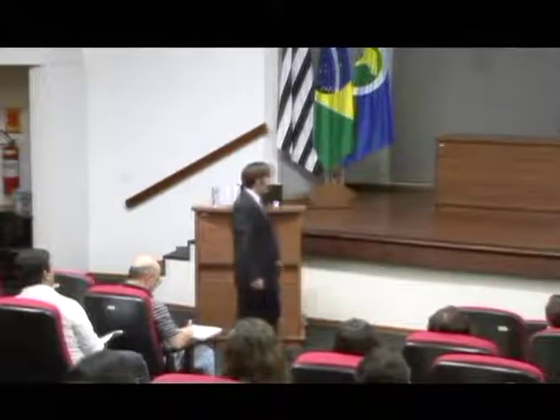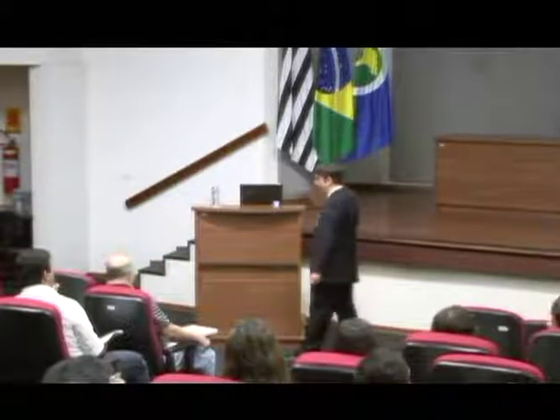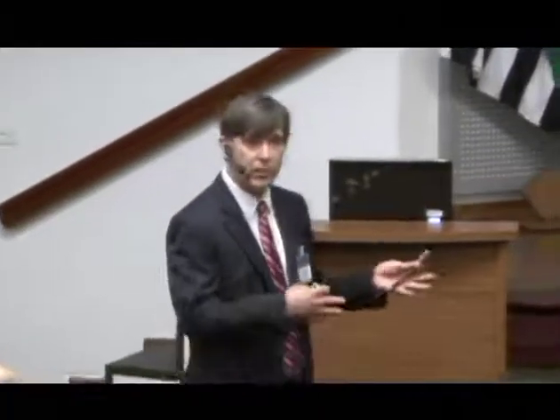So in summary, these non-invasive optical modalities can be useful in detecting precancer and cancer in vivo. They are often best used in combination, where different types of modalities have different strengths and different weaknesses, and they can complement each other. They can be used in different settings, including the preoperative, intraoperative, and postoperative settings, in surveillance of high-risk patients, and in the hands of an experienced and knowledgeable clinician, they can also support screening in a more low prevalence community setting. So that is all I have for today, and I'd be happy to take any of your questions.